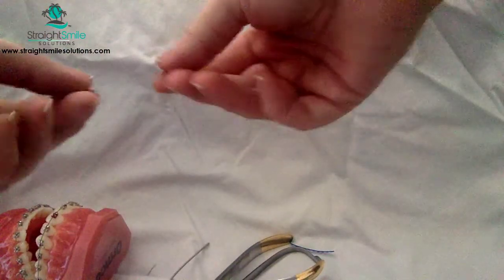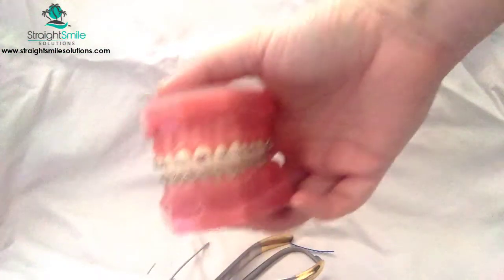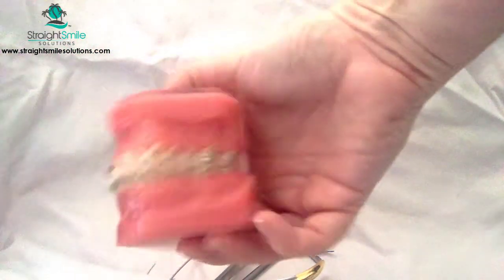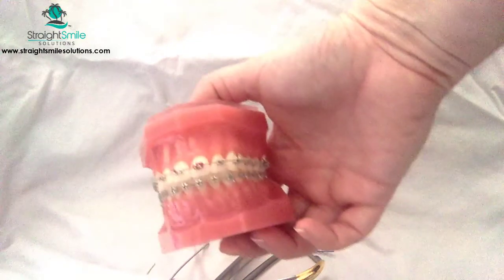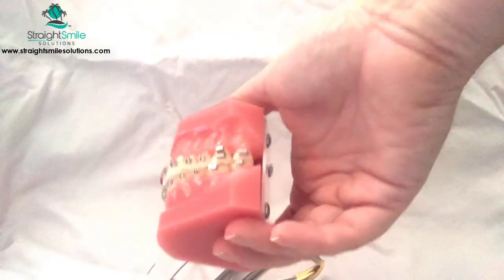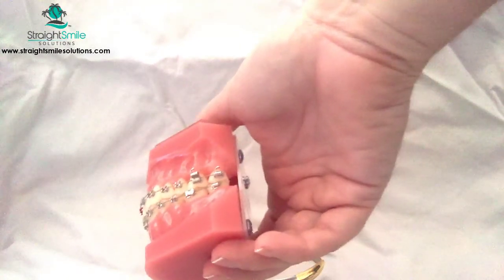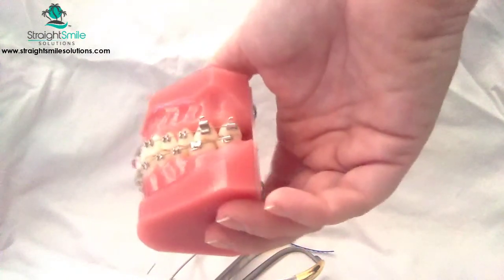You can take any wire, and let's just pretend that we have a sectional wire going on. A sectional wire is an incomplete wire. It's a wire that doesn't go from molar tube to molar tube, so you might be stopping on a bracket somewhere. Maybe it's a phase 1 case. Maybe you've got some big spaces and you want to make sure it's not going to pull out the back. Lots of reasons you might want to do this.